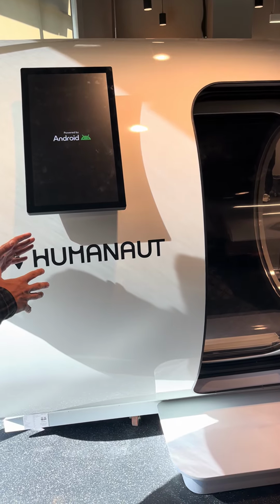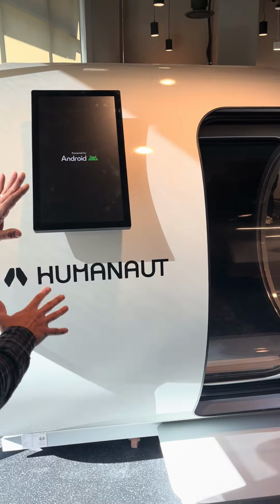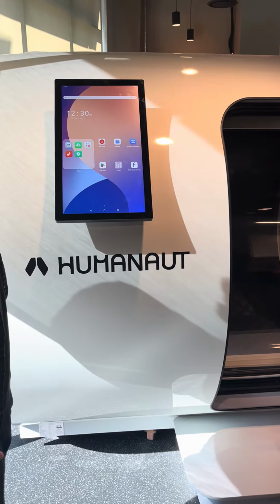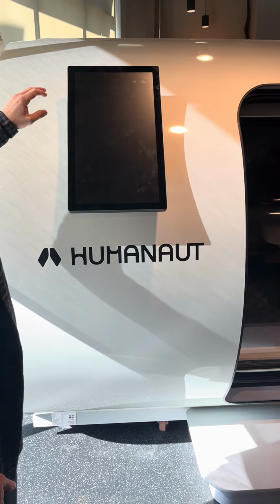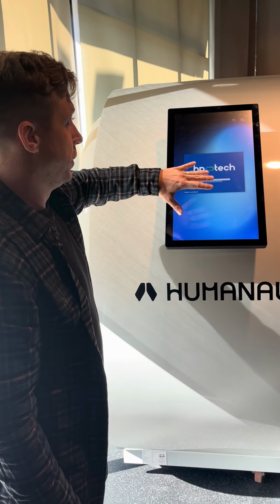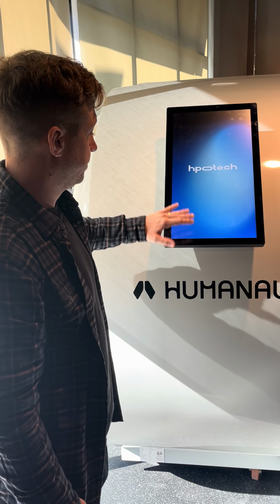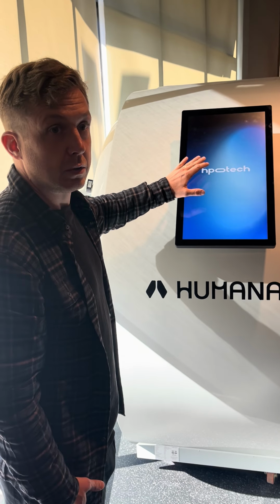That tablet with a fully kiosk browser. If you're driving the chamber from the inside, if you're using the tablet for entertainment, then you can just power it on and then select whatever app you're using for entertainment. So this is going to auto boot into fully kiosk browser. The chamber emits its own Wi-Fi, so this tablet's going to connect to that chamber Wi-Fi. If you connect to a different Wi-Fi, then it's not going to properly boot the chamber control software. Does that need to go off every single day?